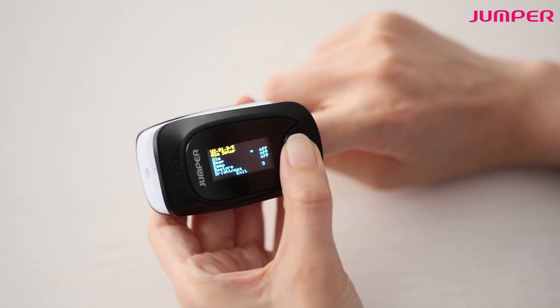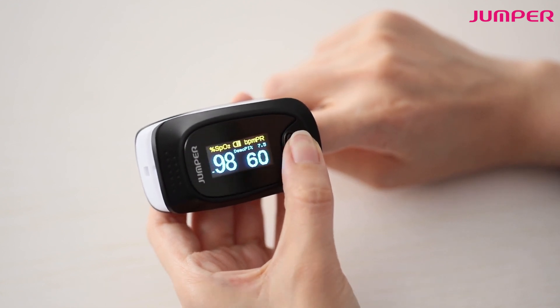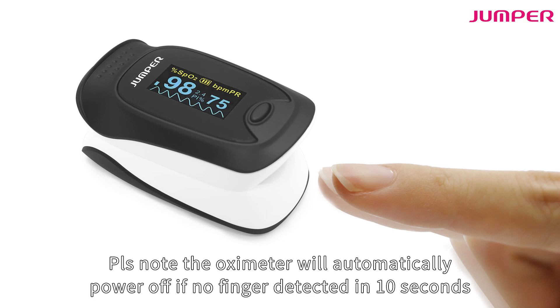A demo mode is available for unit display. Please note the oximeter will automatically power off if no finger is detected within 10 seconds.